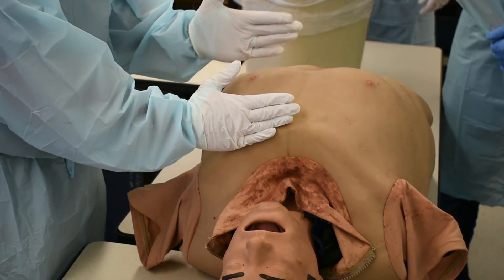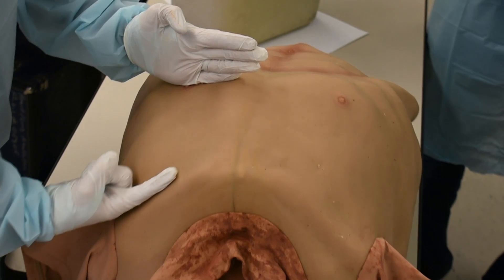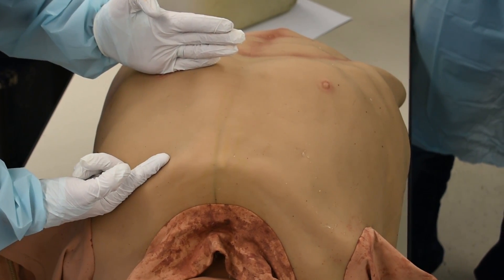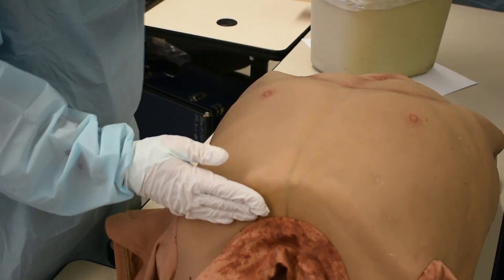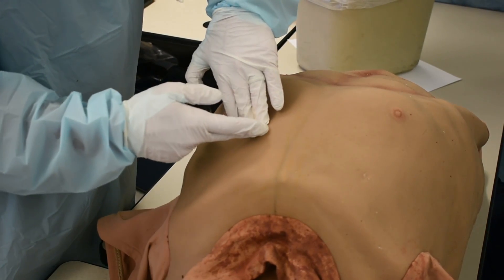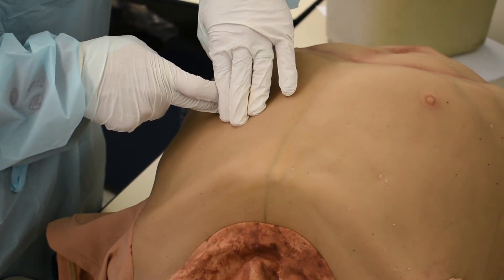So you're going to expose the area. I find the patient's clavicle and I find their anatomic nipple line — that is rib four, T4. Your first rib runs just under your clavicle. So we're going into second or third intercostal space, mid-clavicular line. I have rib one, I have rib four — I automatically cut that distance in half and start palpating. I can feel their rib right along my finger border here.